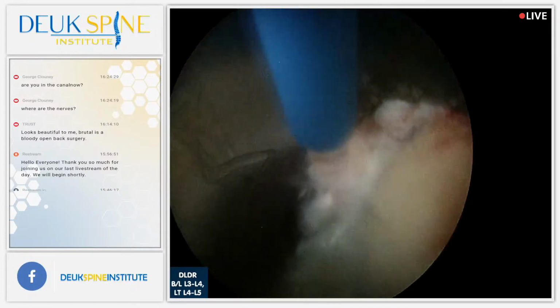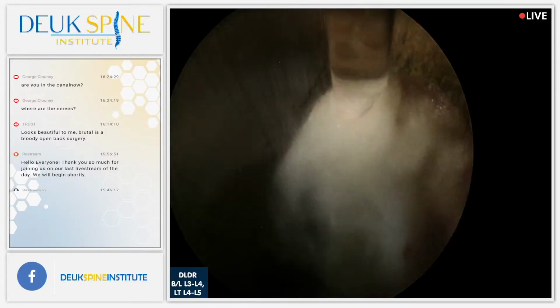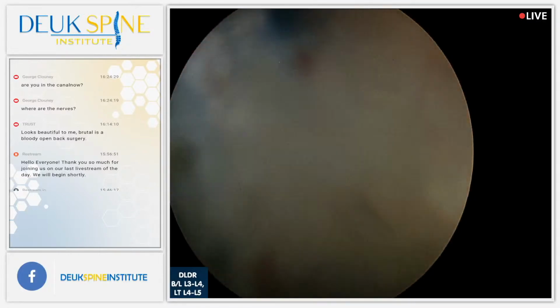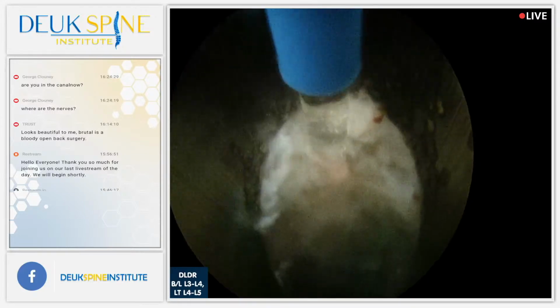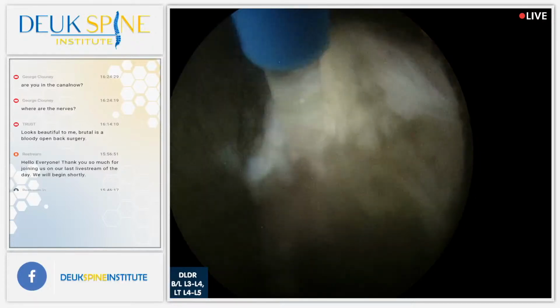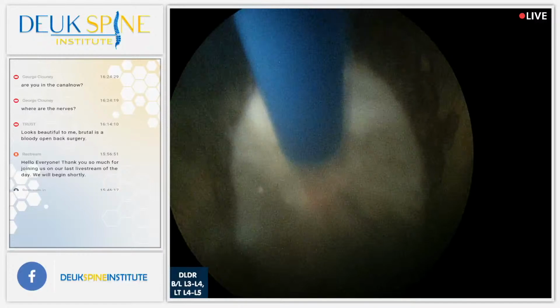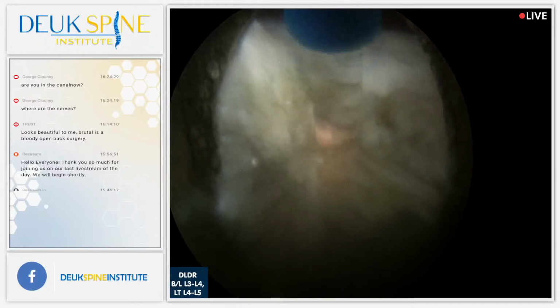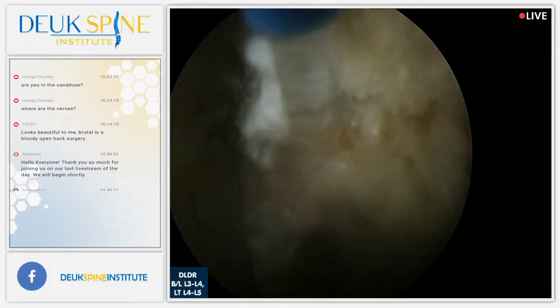I'm going to use the laser to clean this up. There's still a little bit of herniation underneath the nerve, a little bit of fat right there, making it hard for me to see. But this stuff right here is pushing on the nerve, so I want to get rid of it. This is herniation still, and foraminal ligament. Ligament within the foramen.